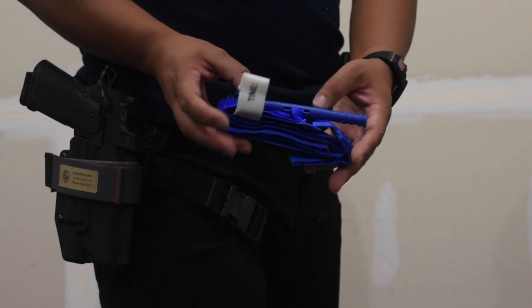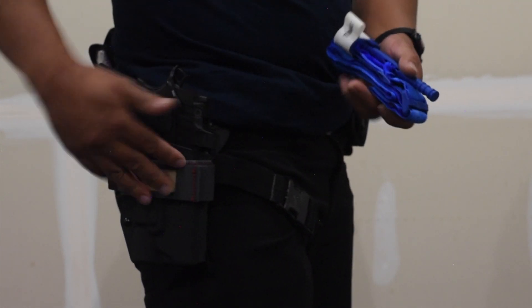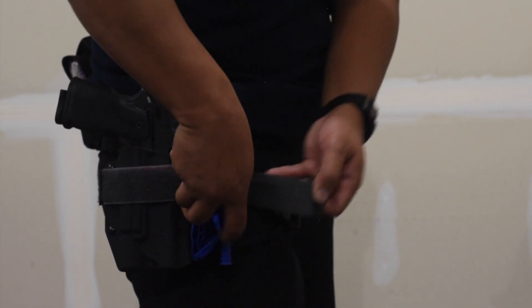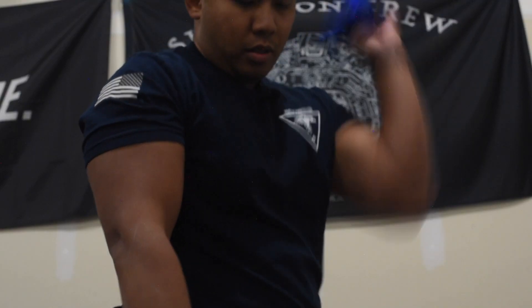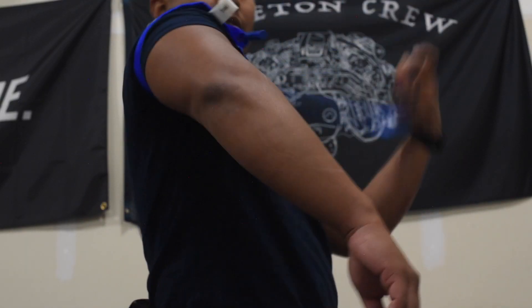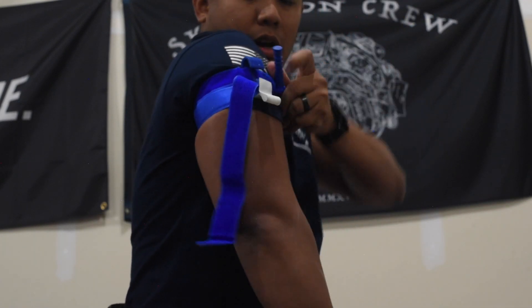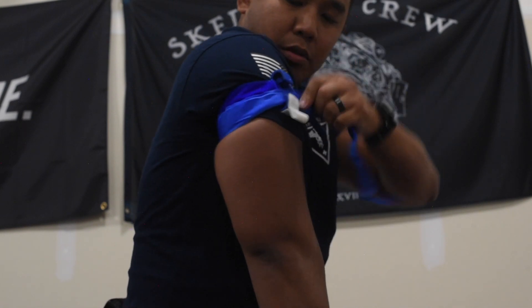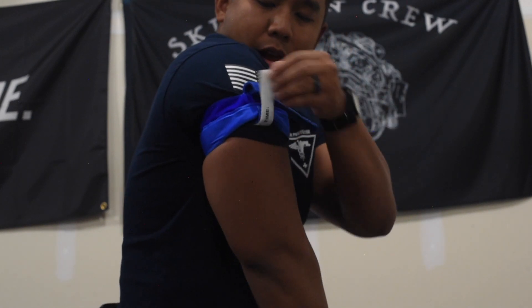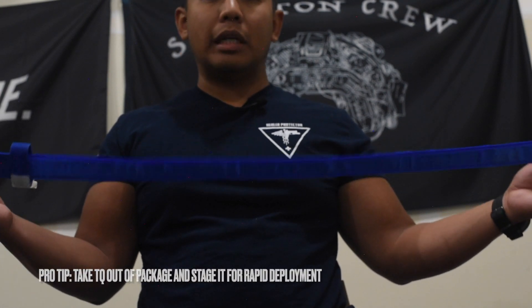The Gen 7 CAT tourniquet is already staged and ready to go. I've used it multiple times in training and will continue to use it. For deployment on my Condition Grey sling retainer: get it as high as I can, pull the slack out, twist the rod — should be good after two to three turns, already feeling the tension, it's tight. Loop it through, put on the time tab, mark it. That's how you do a one-handed tourniquet application. I'll put it back to practice more repetitions with the training tourniquet.